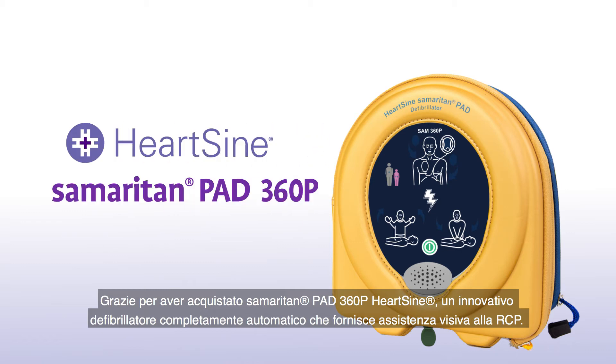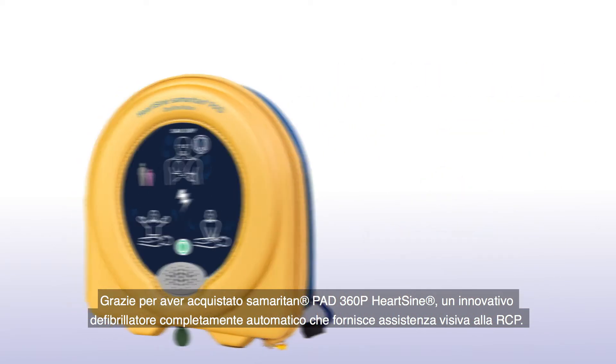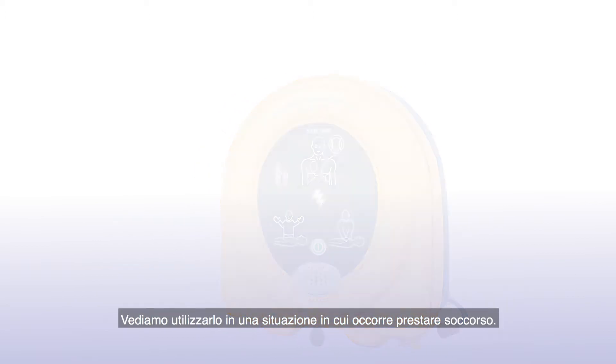You have purchased a HeartSign Samaritan PAD 360P, an innovative, fully automatic defibrillator that provides audio-visual CPR coaching. Let's look at how to use one in a life-saving situation.